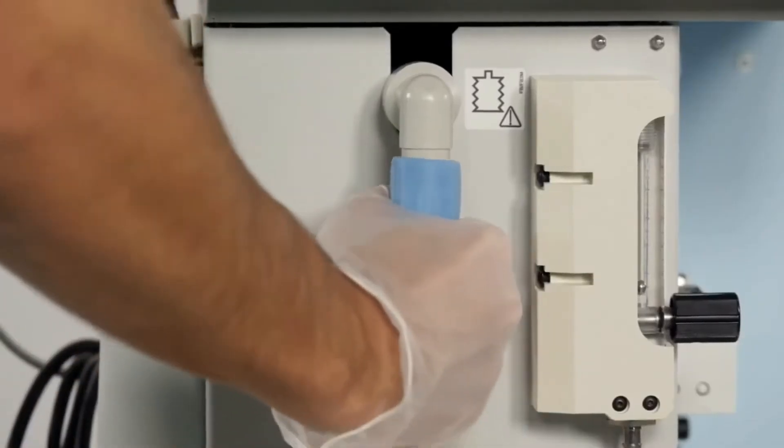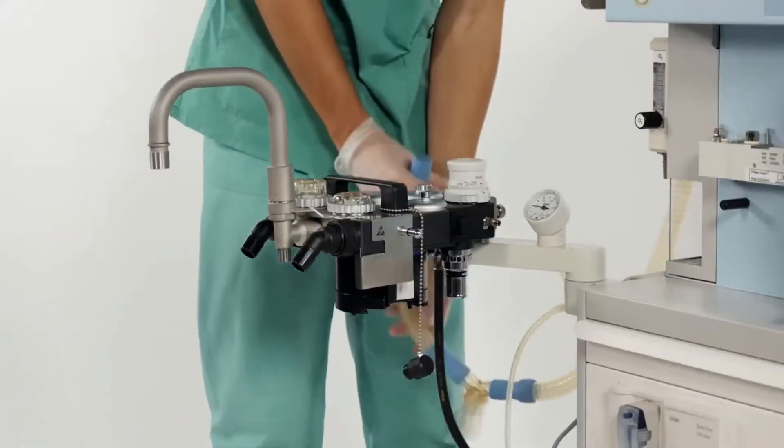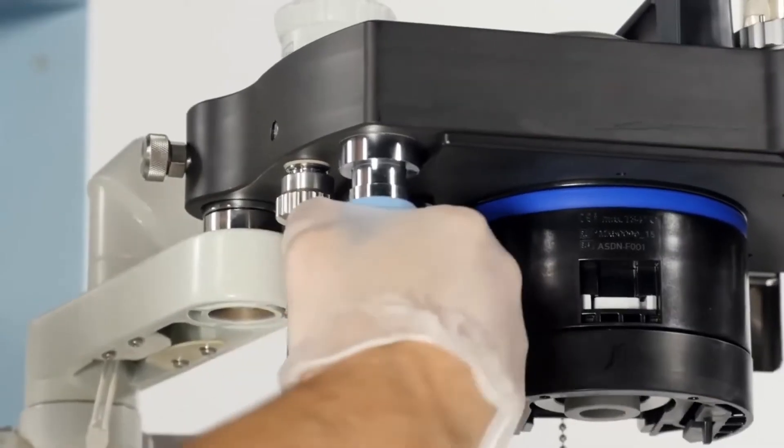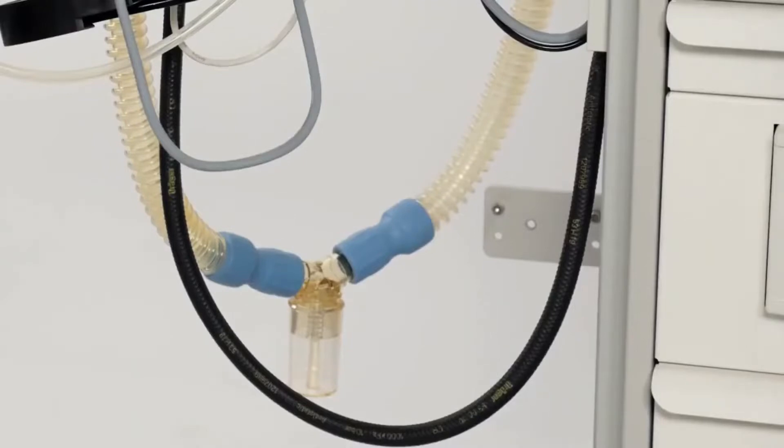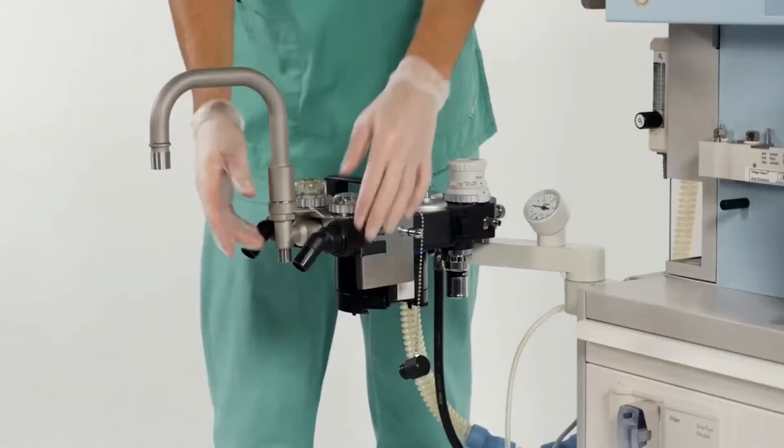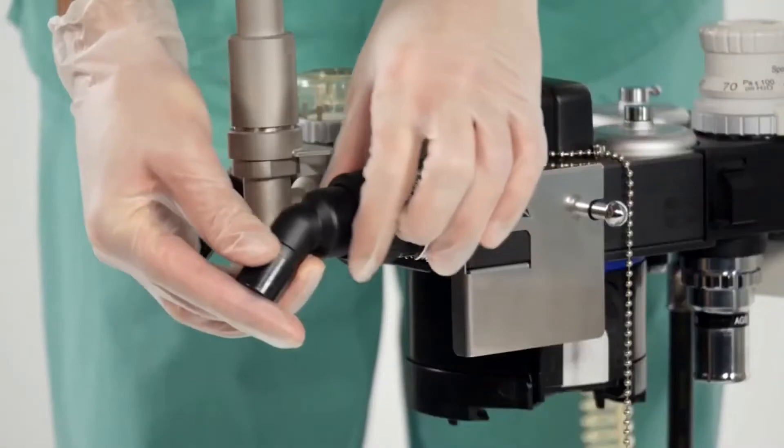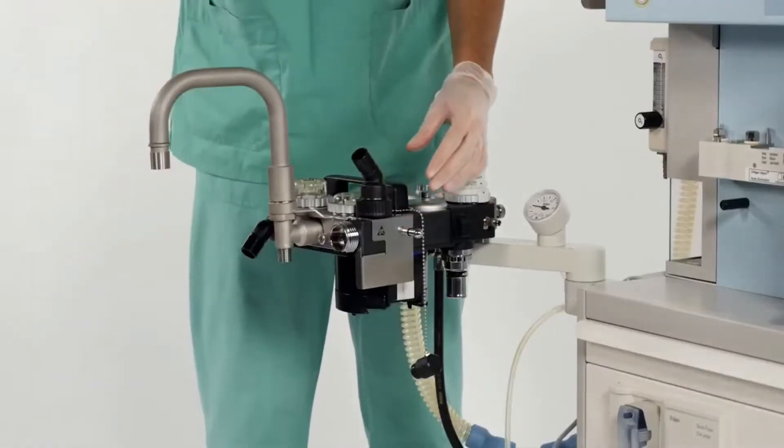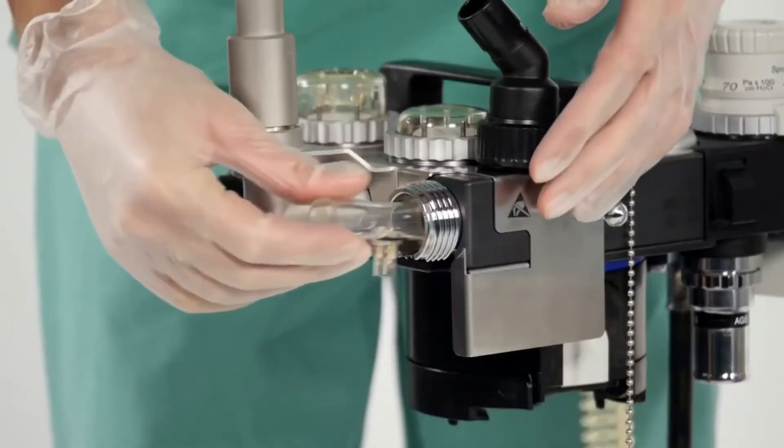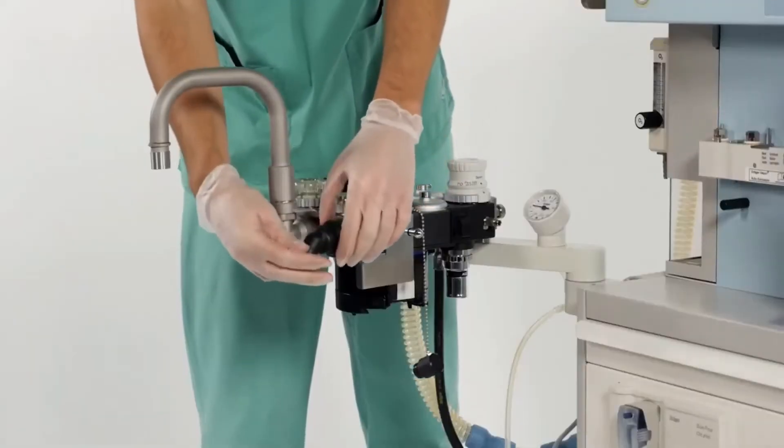Attach the ventilator hose to the ventilator and to the conical connector port on the underside of the COSY. Make sure that the water trap is at the lowest point of the connection. To insert the flow sensor, unscrew and remove the expiratory port from the breathing system. Insert the flow sensor and reinstall the expiratory port.